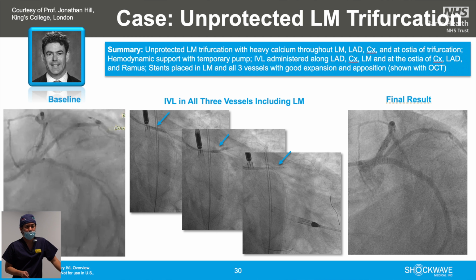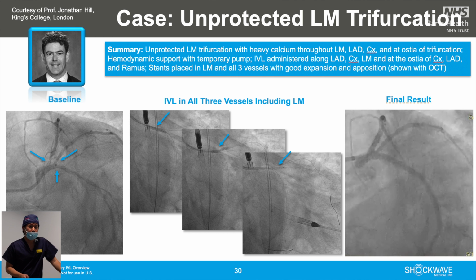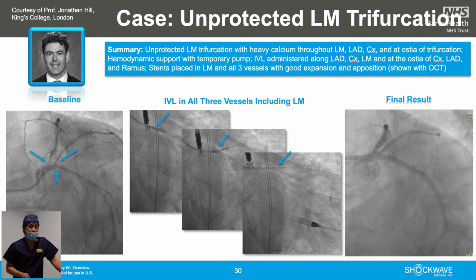I remember this patient was in ITU for more than a week, and the patient was turned down by the surgeon. And so we used 3 Shockwave balloons at the same time there. And the patient was on LVAD, actually, as well. As you can see, their catheter. And after the Shockwave and stenting, you can see the area fully expanded.